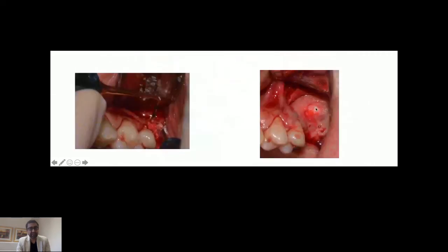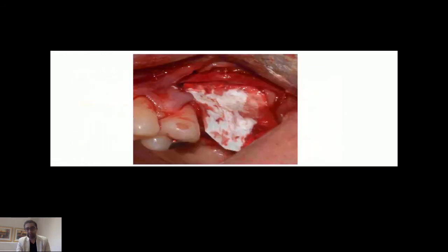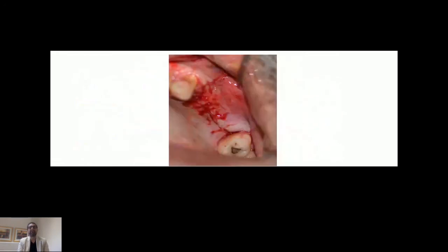Once you've created that gap, you place your bone graft in. We didn't place the implant in this patient because the bone height was not going to give us primary stability. So we just grafted this patient. So the graft is in. You put a GBR membrane on top, and that's the closure. So in a minimally invasive way, you can do lateral sinus approach or lateral window approach as well. You don't have to make those big lateral windows anymore.